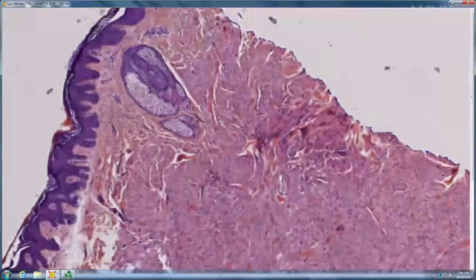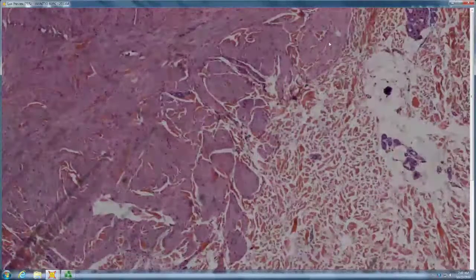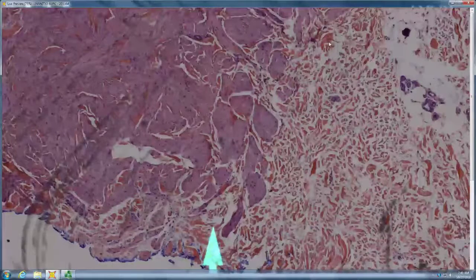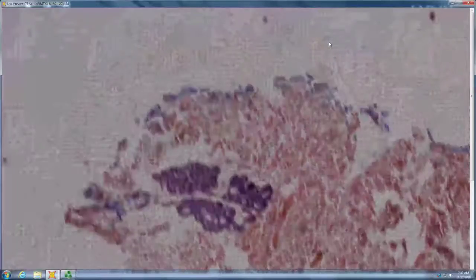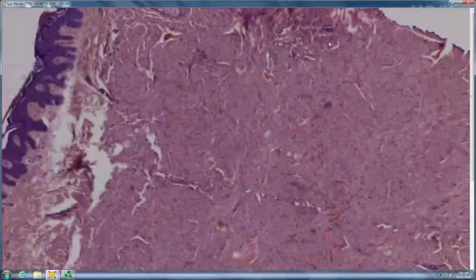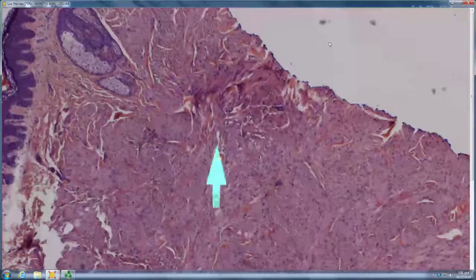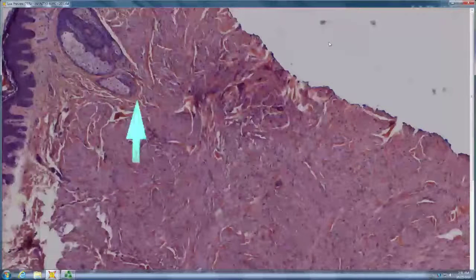So it's probably a spindle cell proliferation, and is it smoothly circumscribed, or does it have sort of a spiky pinwheel periphery? I think it's kind of well circumscribed. Well, maybe a little bit pinwheel. Yeah, a little bit pinwheely. And I was thinking about dermatomyofibroma or leiomyoma. So in a dermatomyofibroma, you would expect that your adnexal structures would be gone or preserved. Preserved, because DMF doesn't move follicles, right? So DMF doesn't move follicles.